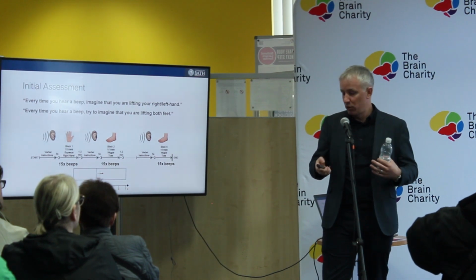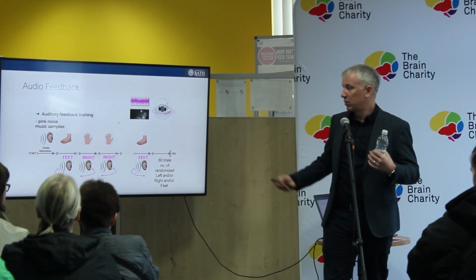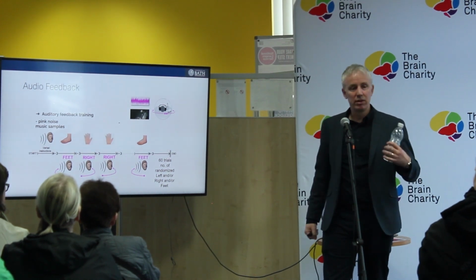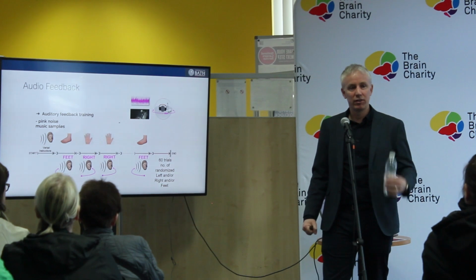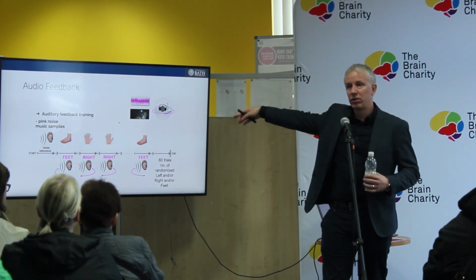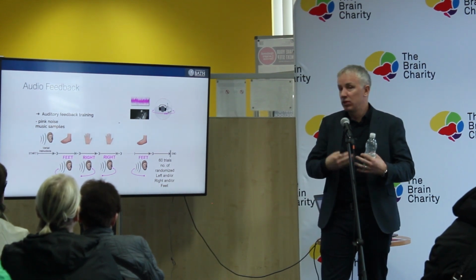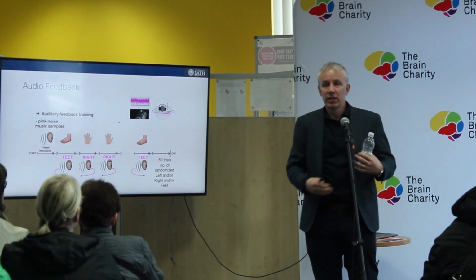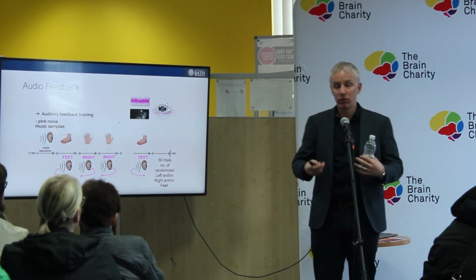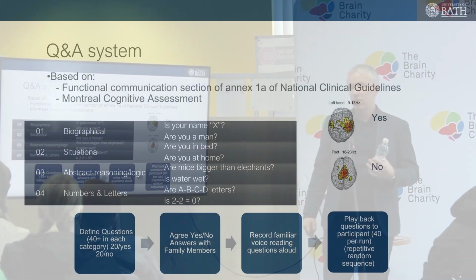And if it is, then we move them on to another set of sessions where they do a similar thing. So they're imagining movement, could be lifting a weight with the right hand, lifting a weight with the left hand, and they're getting this feedback using the auditory feedback, as I've explained earlier. And what we're trying to see is, do they engage over multiple sessions? Can they get better at doing this over multiple sessions? And eventually we get to a point where we can ask closed questions.